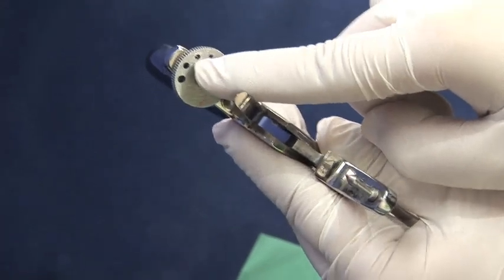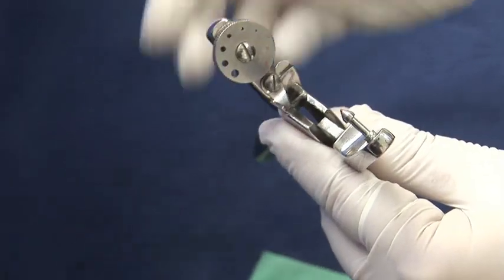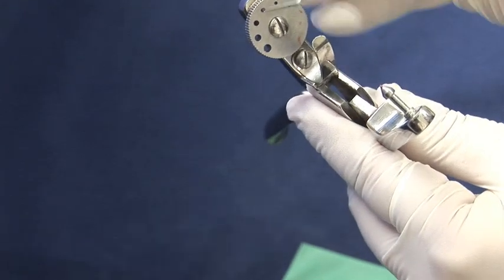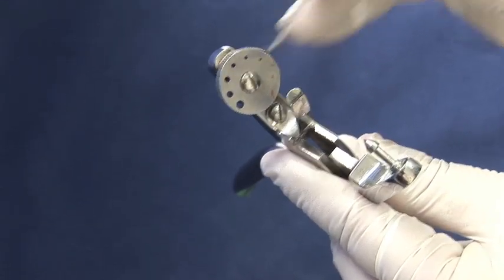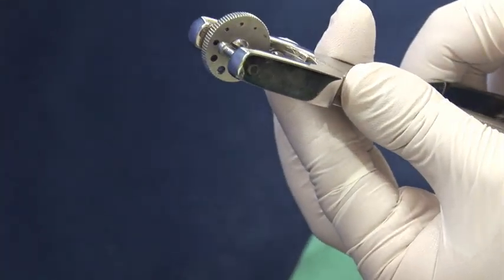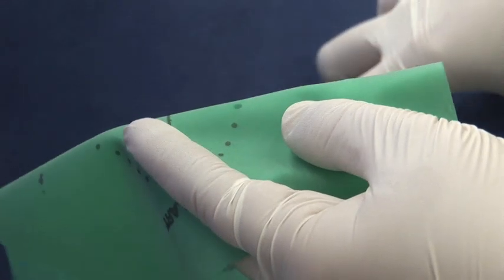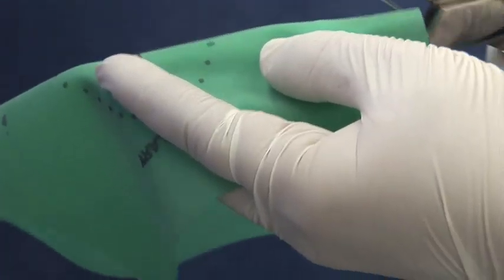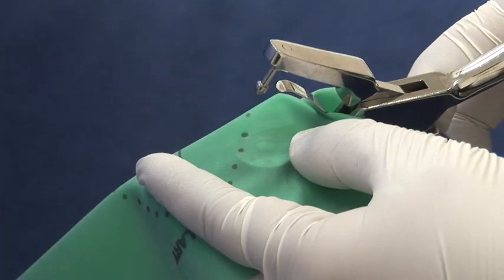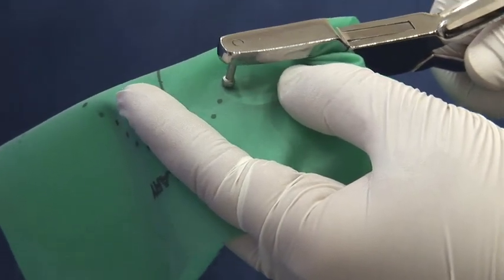First, take the rubber dam punch. The punch has a dial with holes that correspond to the different sizes of the teeth. Select the hole you need. Make sure the punch is free from any rubber dam and ensure the punch aligns well. Take the rubber dam and select the tooth you want.